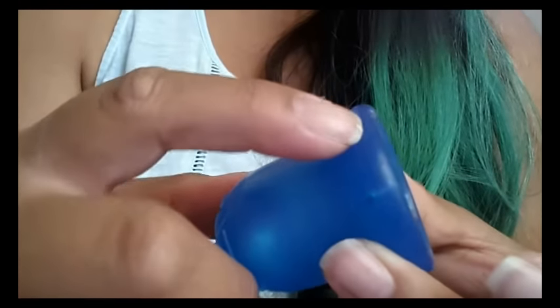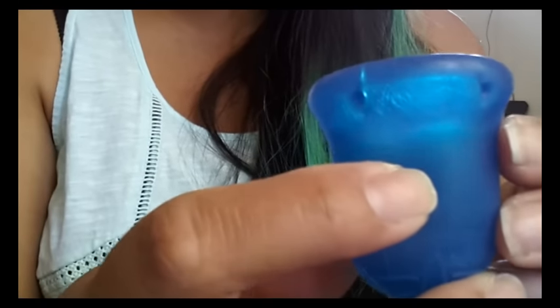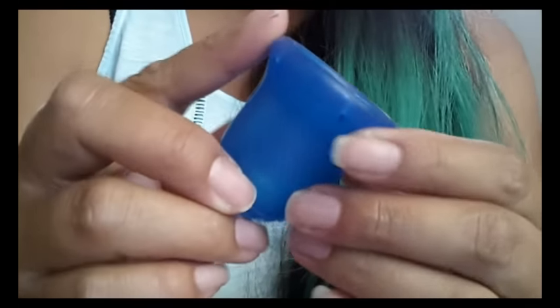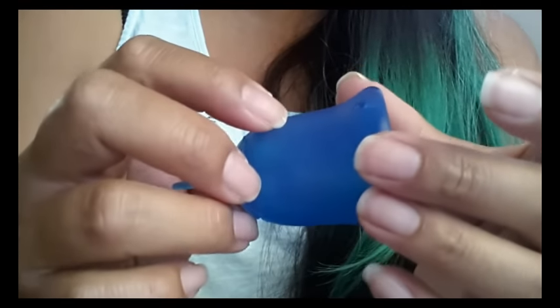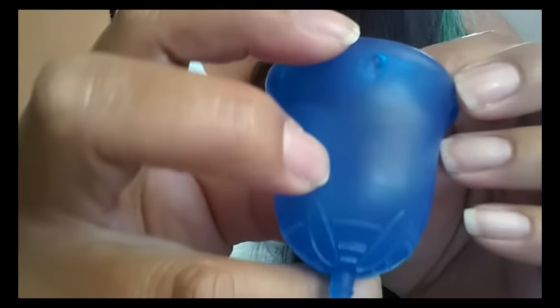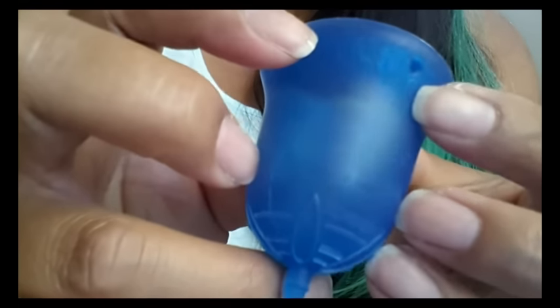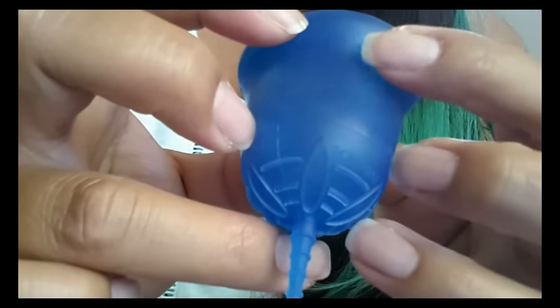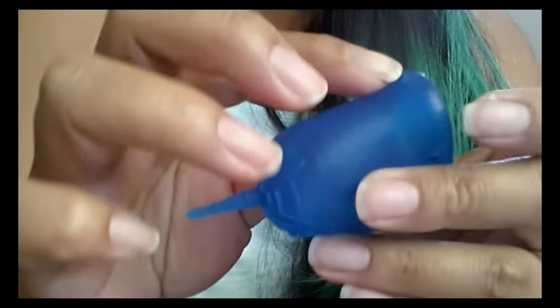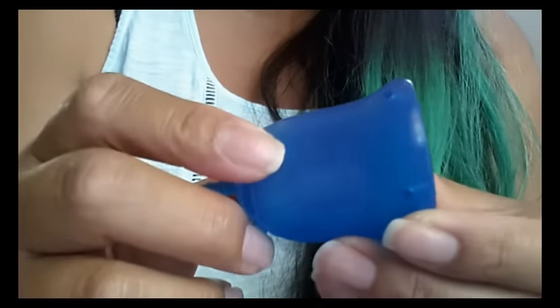Right along the top rim there is a seam but they finished it off really nicely. I can't even feel it with my fingertips — they brushed that out really nice and made it a smooth finish. There are seams around the suction release holes as well from being molded, but again I don't feel those either. They brushed those out nicely and finished them smooth, which is really nice for people with sensitivities.